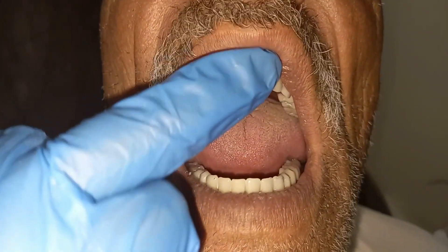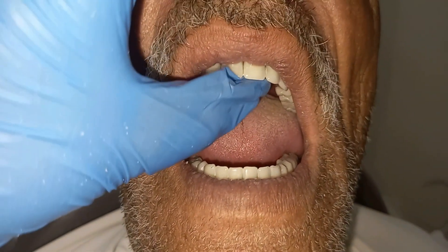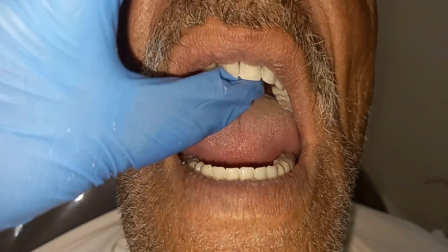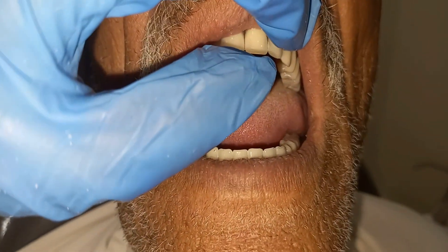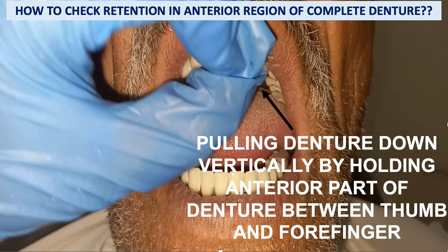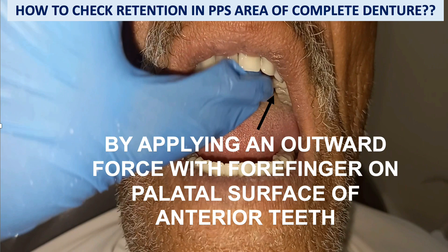To check retention in the PPS area, use a forefinger or thumb on the palatal surface of the anterior teeth and apply an outward force. If the denture dislodges or there is any break in the seal, the denture is not retentive and the PPS is not correctly recorded. You can see in the figures: vertical force is applied at the anterior region, and outward force is applied at the palatal surface to check the PPS area.